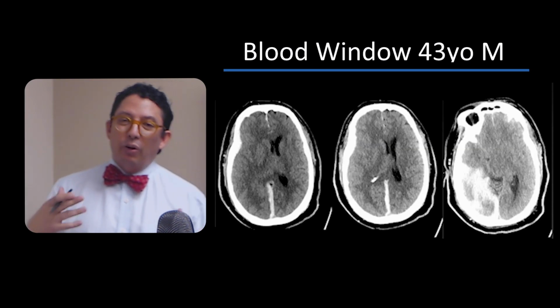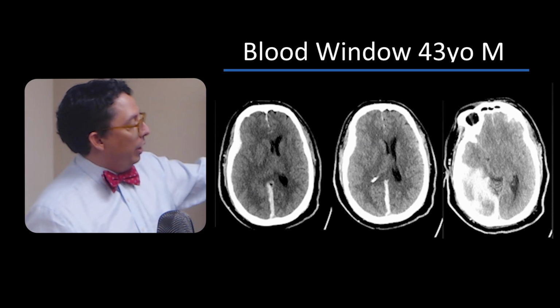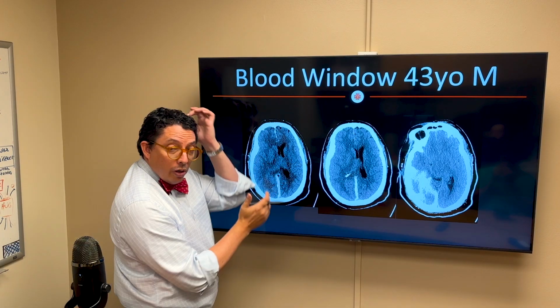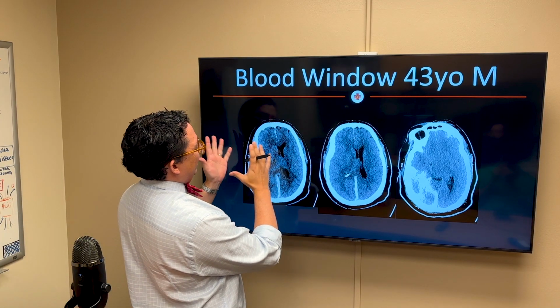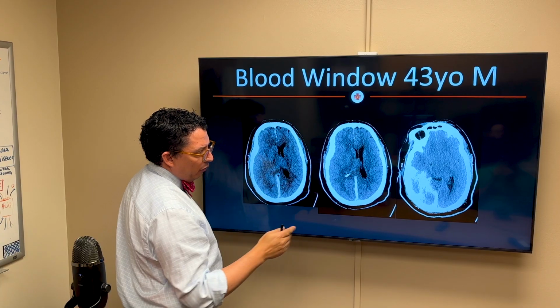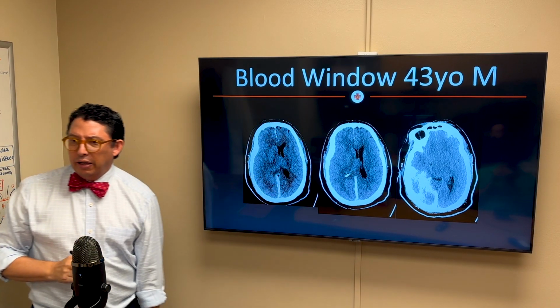Now, why are these things important? Well, this is a case where we have a patient. You can see that the structures of the midline are tilted to one side, and there seems to be a high density that is happening back there. But you really cannot detect what is going on, except that of the high density in the falx and then kind of a white blob that is going on there.